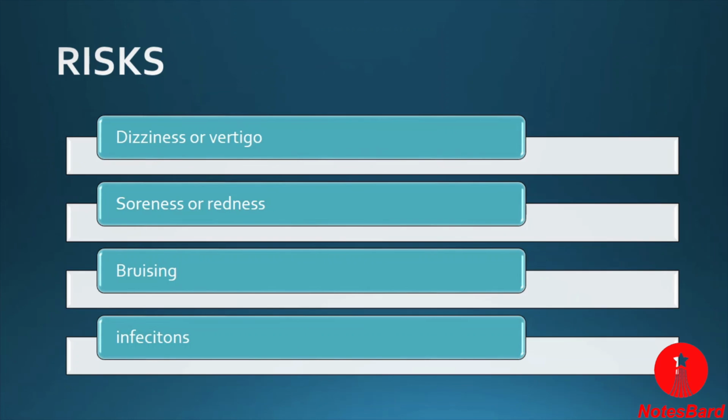So in this video lecture we have discussed the blood smear test, its procedure, and the observations or diseases diagnosed by the blood smear test.